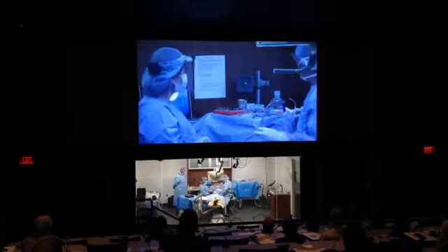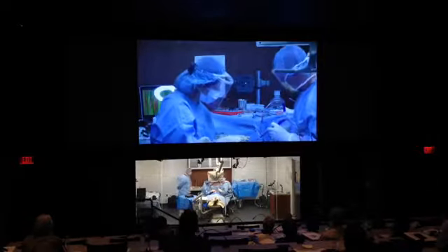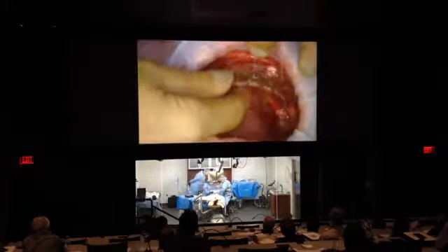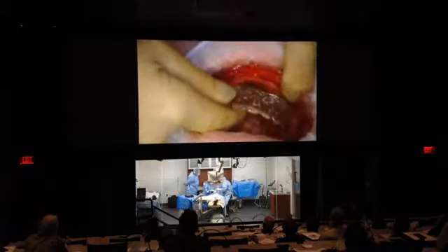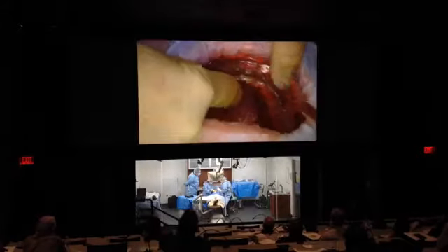Let's check the bone reduction guide as well. All right, Greg, let's take a look. So here in the front is right where it should be. Maybe a little bit I could reduce on the left on the canine. Yeah, we'll just flatten it out.